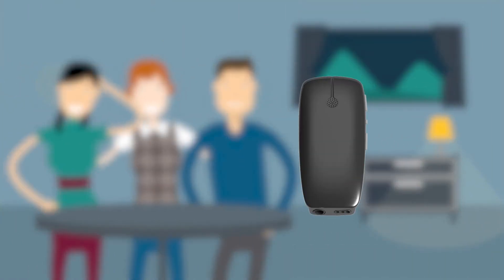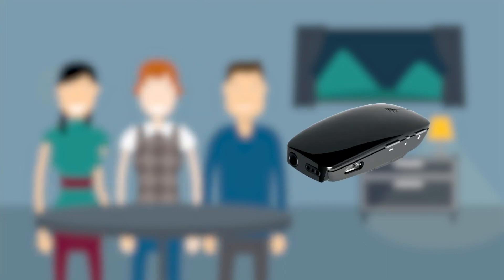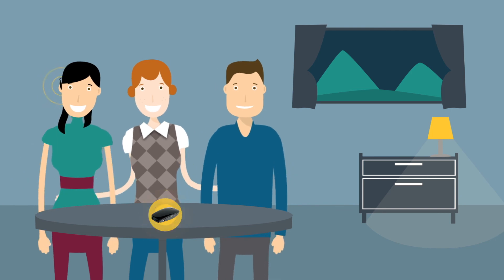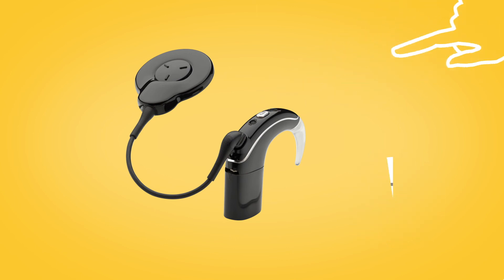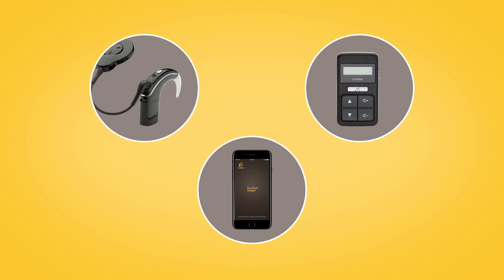If you have a Mini Microphone 2+, you can place it on a table to listen to multiple speakers in a group setting. You can stream audio to your Nucleus 7 sound processor from a mini mic by pressing and holding the sound processor button, using the CR310 remote control, or via the Nucleus Smart App.